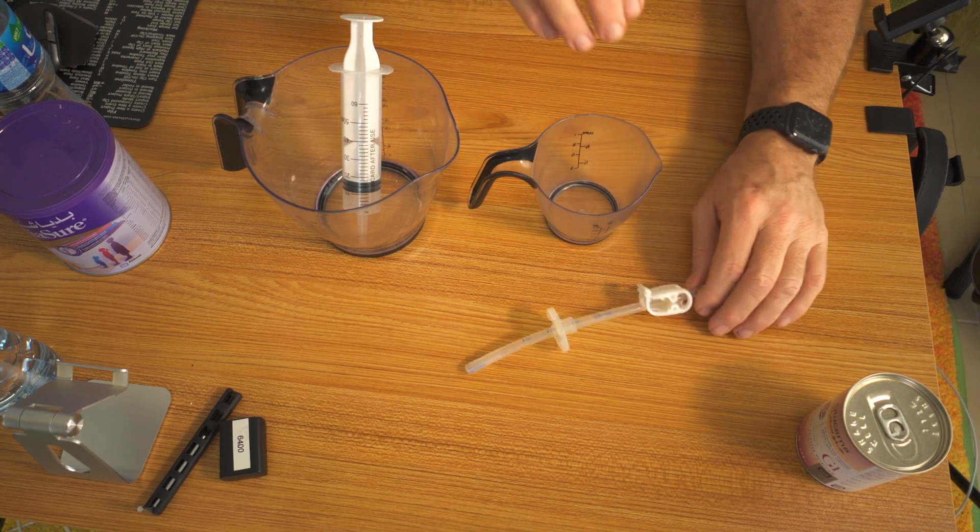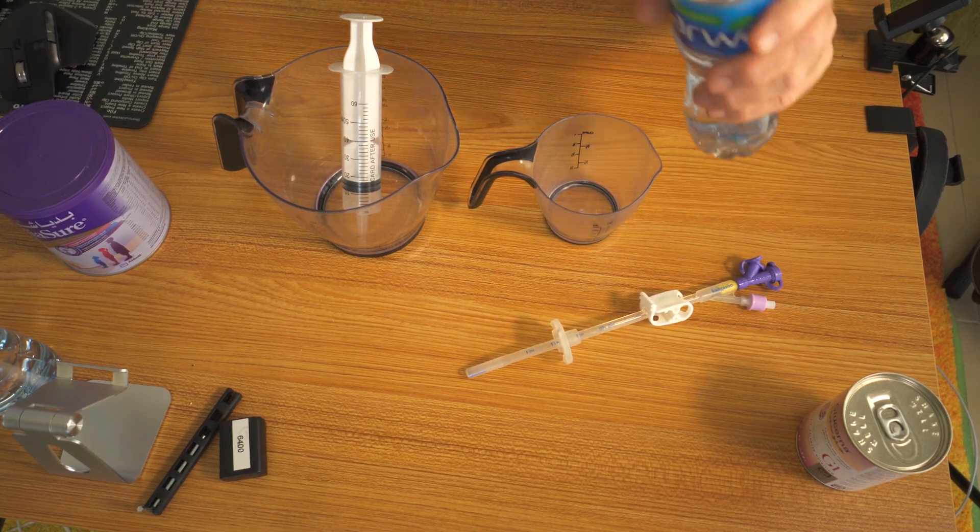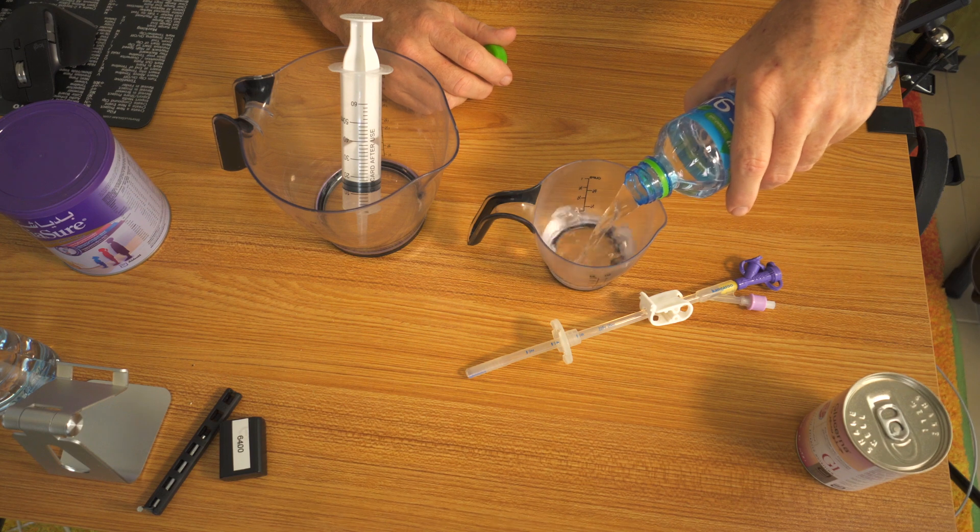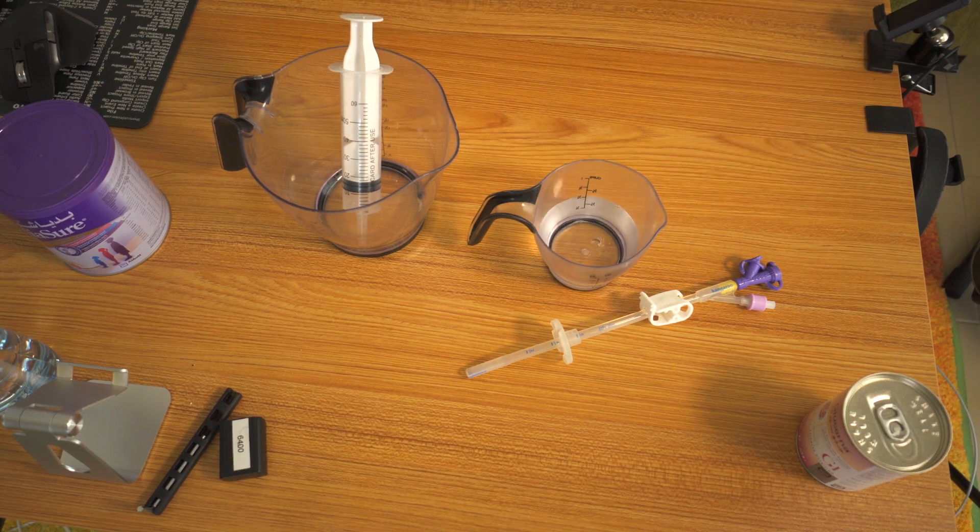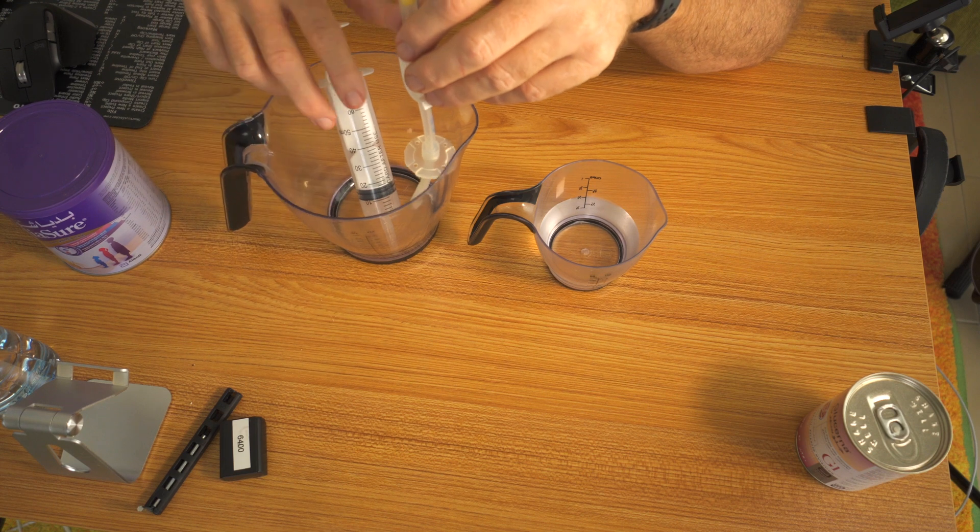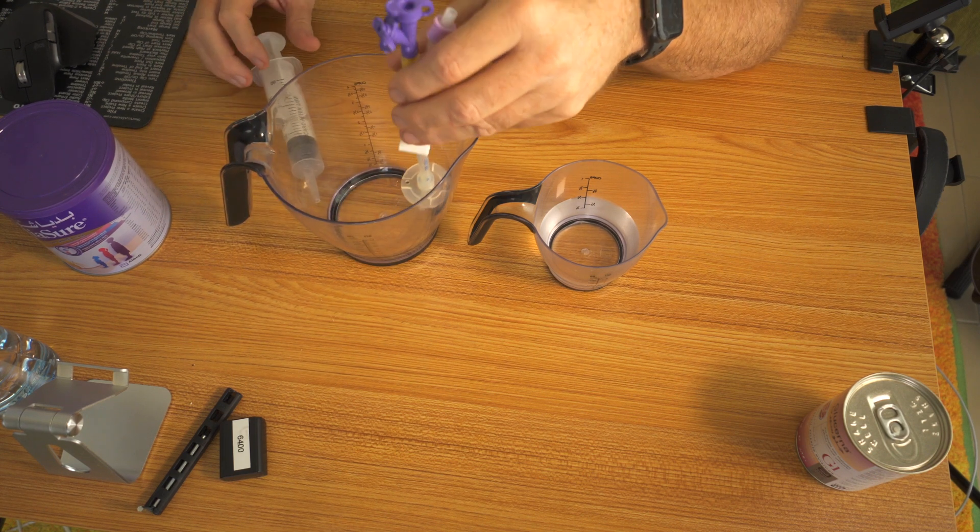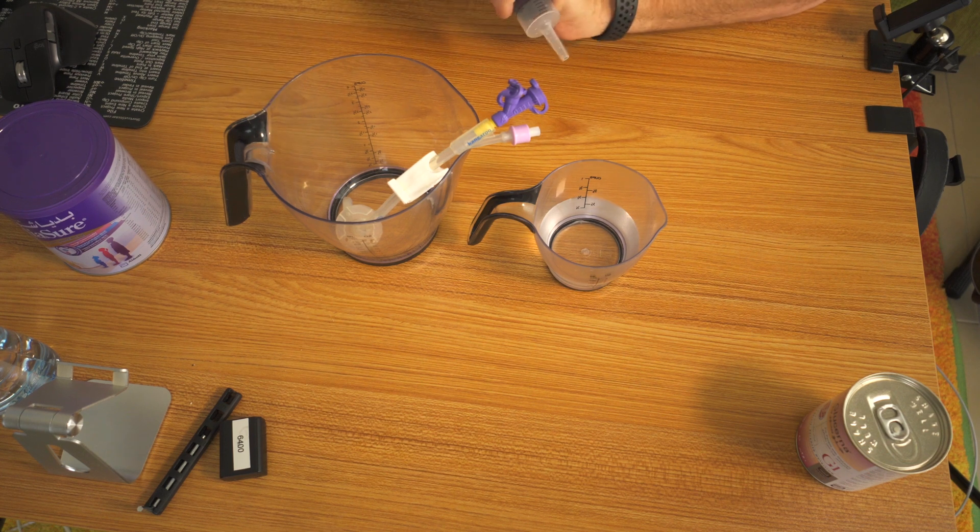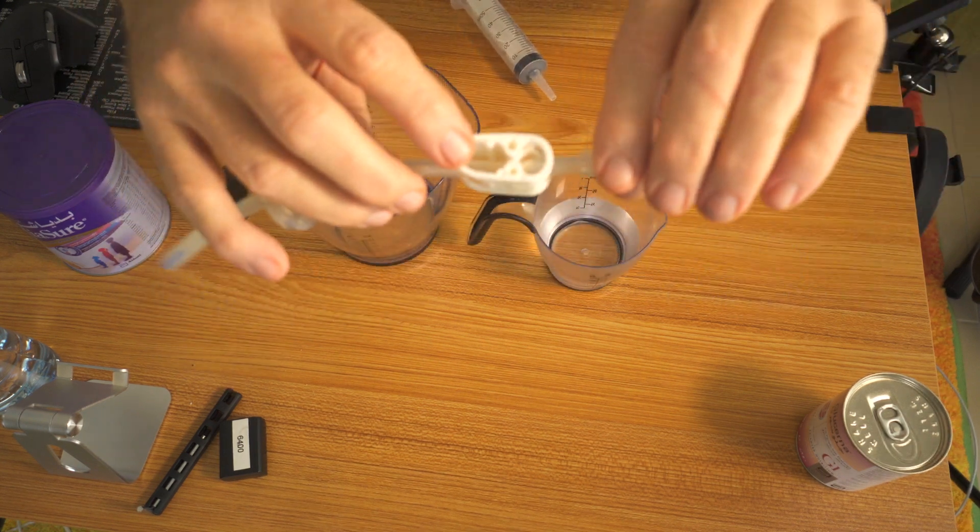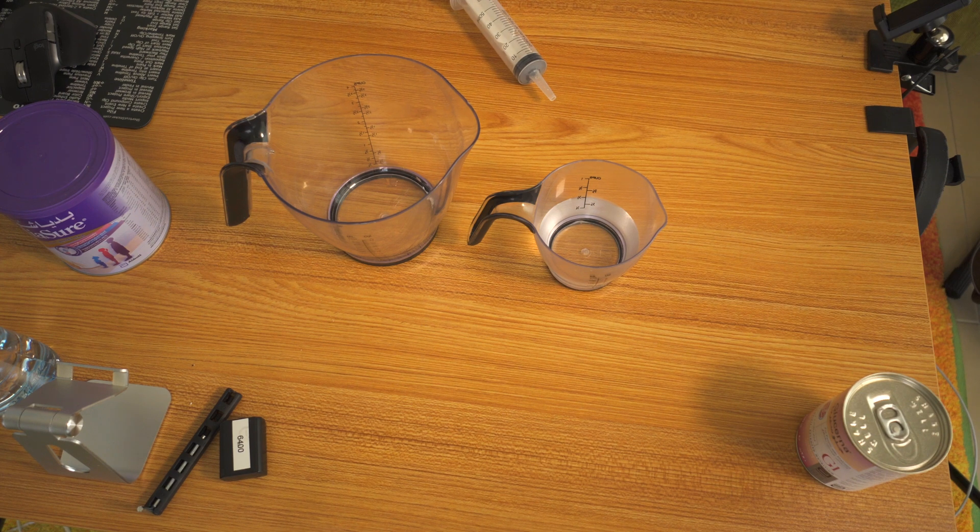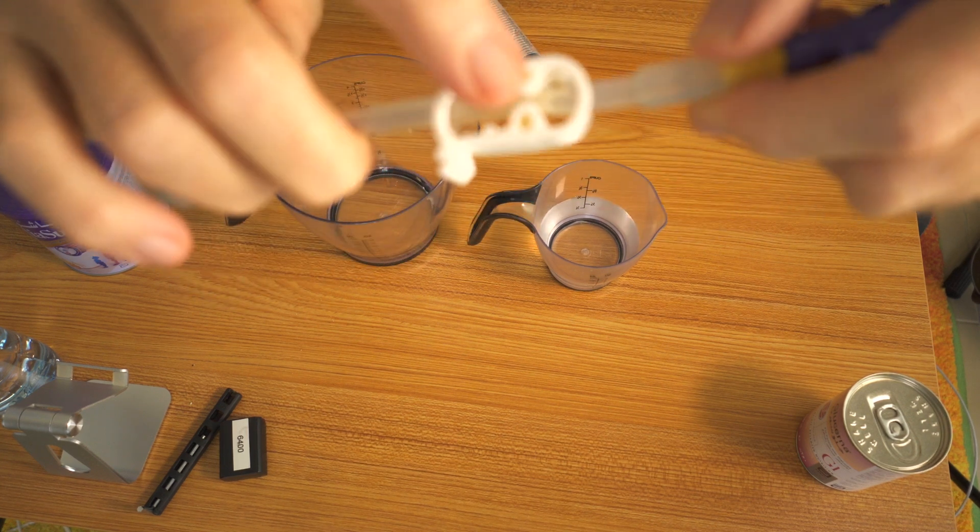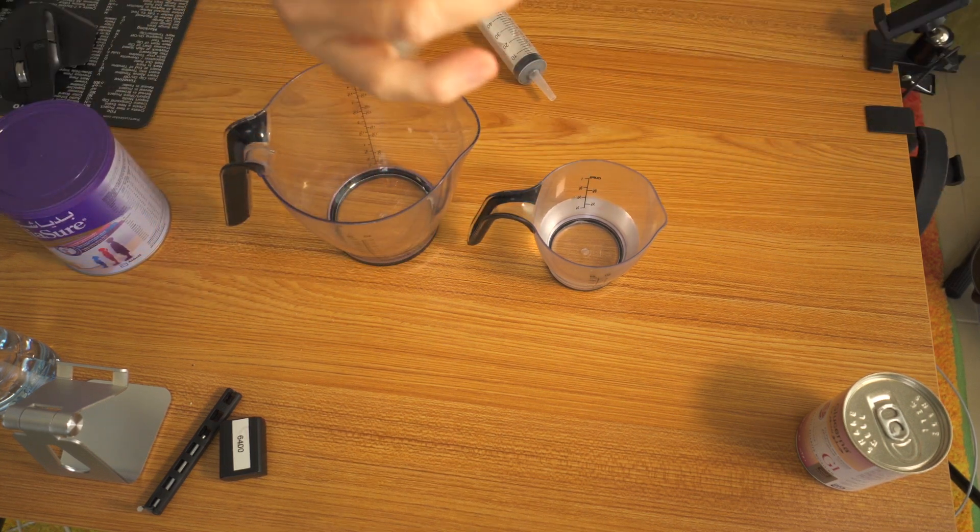First thing I want to do is take a little bit of water and pour it into a measuring cup, about a half cup. I'm going to take this stomach tube. First thing I would do is make sure that the clamp here is closed. That clamp is closed inside and is keeping liquid from coming in and out. Anytime you use it, you want to make sure that clamp is closed. That keeps things from going in and also keeps stomach contents from coming back out.